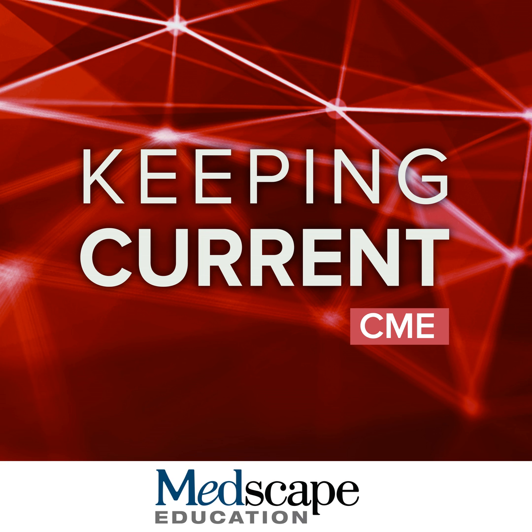And another key finding that you want to look for and comment on, of course, is microvascular obstruction. Sometimes we'll talk about that as MVO. And that is that area of very low signal intensity within the myocardium. And I think the simplest way to think about this, sometimes when I'm explaining it to our trainees, is that the myocardium was so infarcted, so dead, that the gadolinium contrast couldn't even get there to be retained. So, there's no reflow. That has not been reperfused.